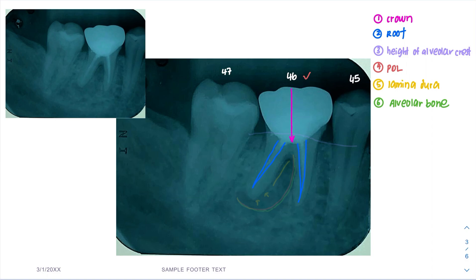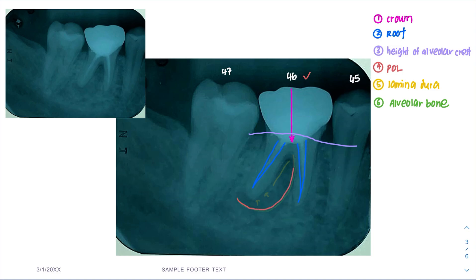Next is the height of the alveolar crest. The height of the alveolar crest has no relevant finding. The fourth one is the periodontal ligament space. The periodontal ligament space — you can see — is widening at the apex and extends until the furcation area.